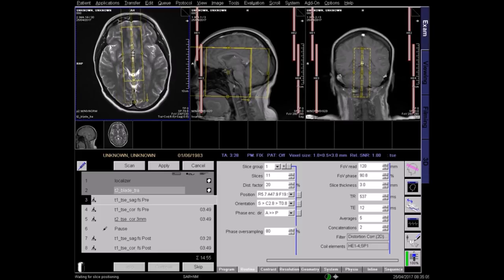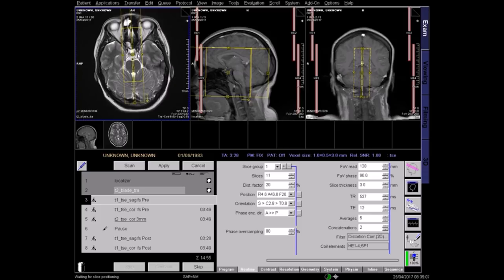Scroll through and identify the pituitary gland. Your slices must be sufficient to cover the pituitary gland side to side. Make sure of this by including the right and left carotid arteries on either side. Check that the block is centred on the pituitary gland on both the axial plane and the sagittal plane.